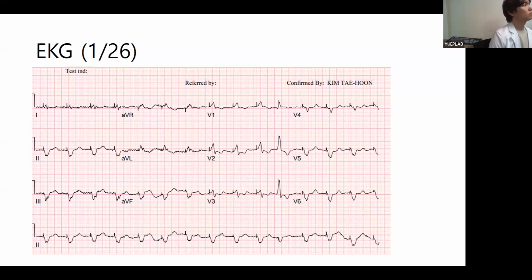Okay. So the current data, limited data and retrospective studies, favors the CSP. It is because the patient population has been different. The CRT-D patient is in a worse condition, with significant heart disease, and the CSP patient has mild heart failure. So that is Professor Kim's thoughts. And especially in patients with septal scar and fibrosis, CSP doesn't work.